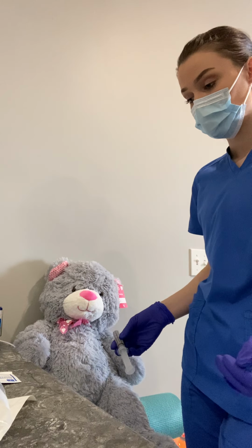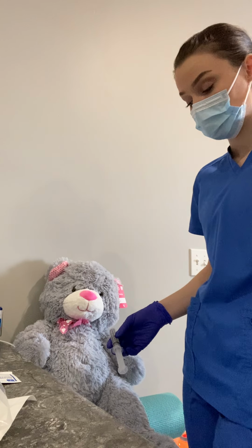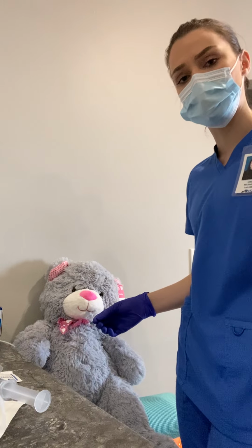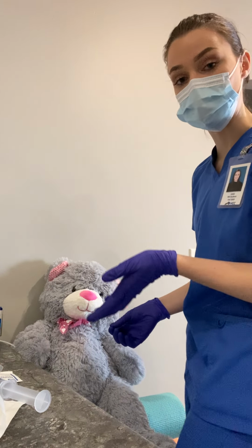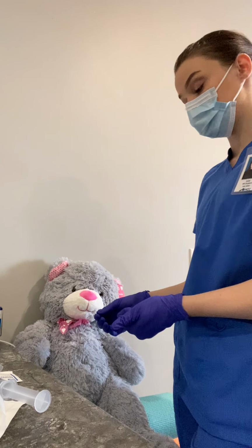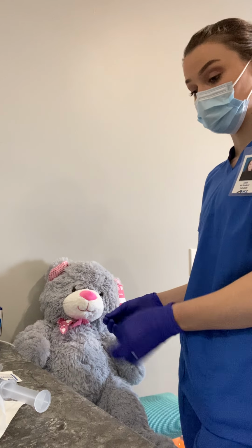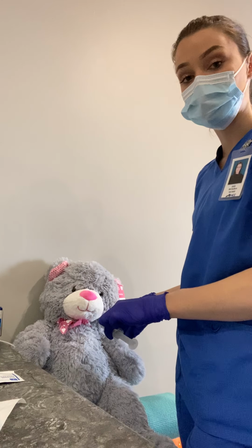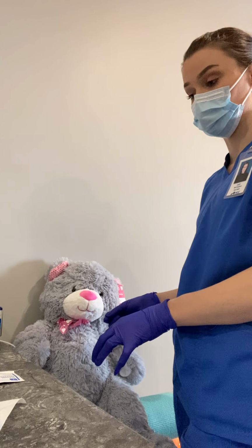I'll flush that, and then whatever the physician had ordered for my patient, I'm going to take this off. So if he ordered a blood pressure medication, I'm going to let her know, okay, this is for your heart, this is for your blood pressure. I'm going to connect that, and flush it at the prescribed rate. Disconnect that, and go ahead and hook up my normal saline again, and flush this at the prescribed rate as well.